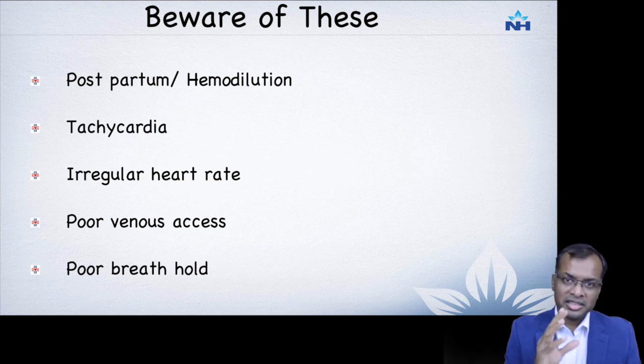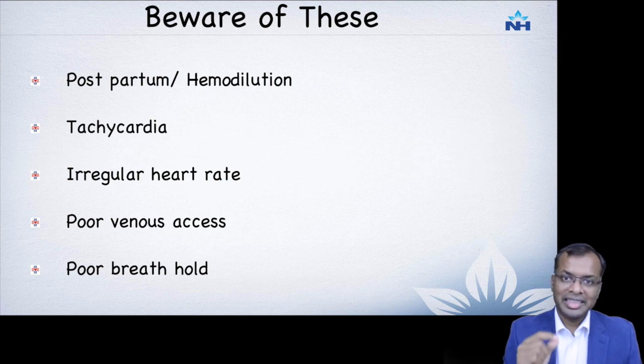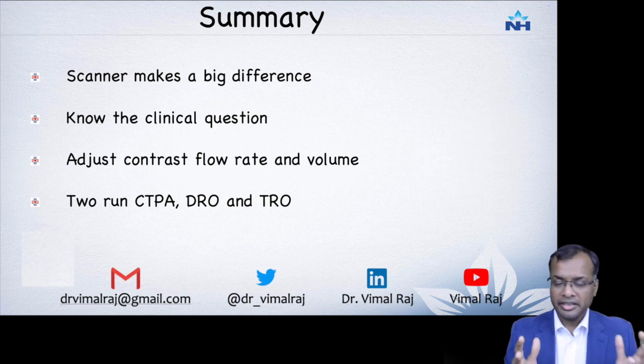If the contrast does not go at a higher rate, you will not get good quality. Breath hold cannot be emphasized enough. It is important that there is good breath hold in all your patients, whatever scans you are doing. So finally, to summarize, scanner makes a big difference. If you have a good high-end scanner, most of these scans will be easier and you will not have to do too much manipulation.